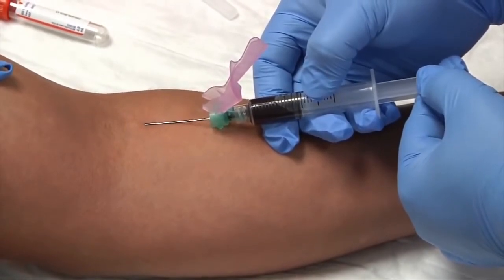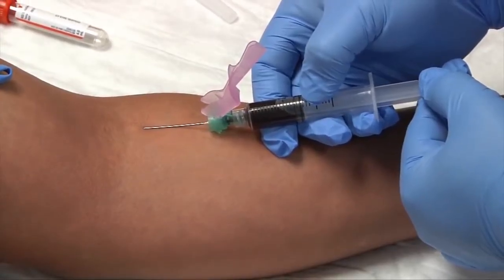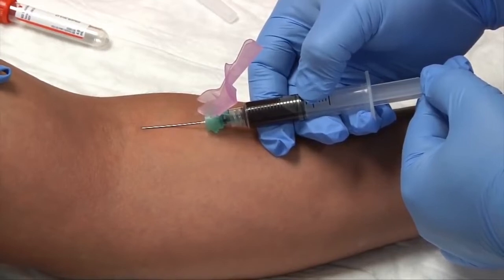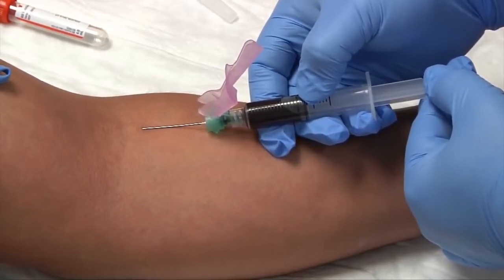And as we're doing this, keep in mind your patient may be nervous. It's okay to talk to your patient. Probably would put them at ease too. This could take a couple of minutes to draw the amount of blood you need.